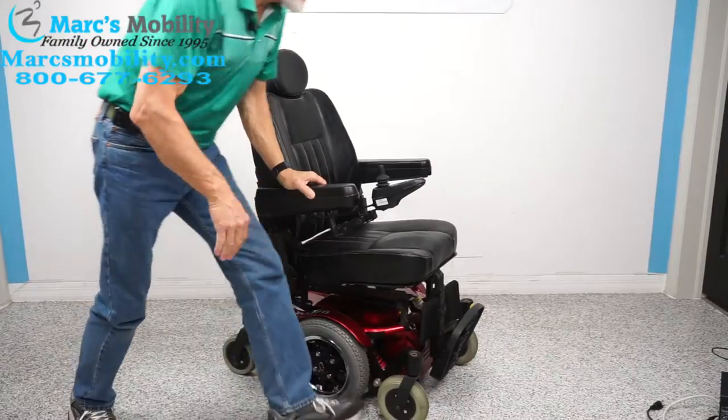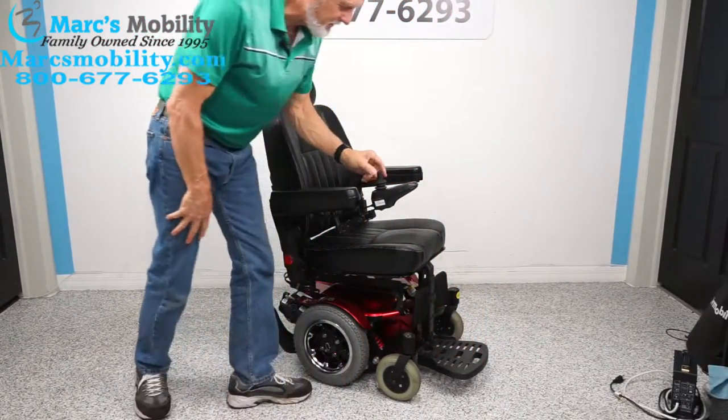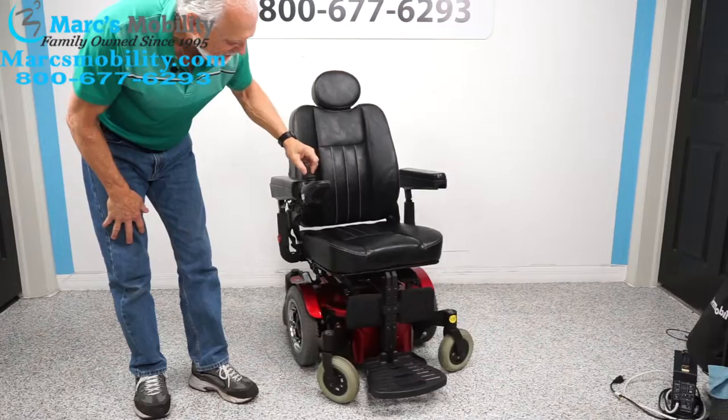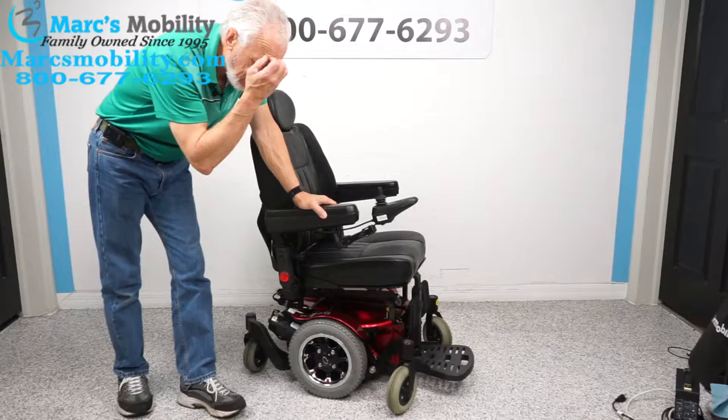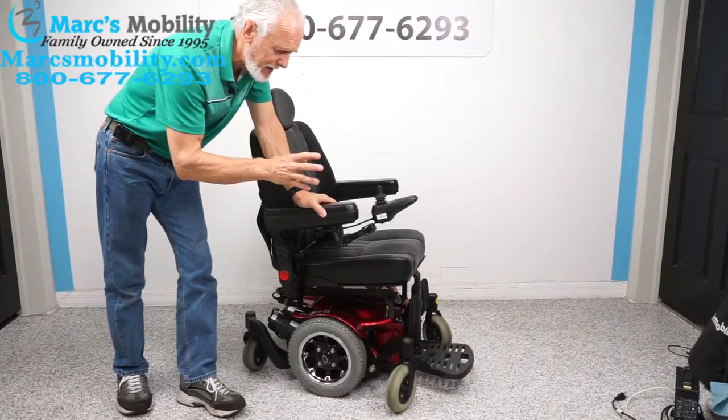That's how you change the batteries in this chair — very simple. Of course, if you don't know how it works, the first time I did it I almost took the whole chair apart. So that's how easy it is to change the batteries. This is the Quickie Pulse 6, with a 300-pound weight capacity and a top speed of six miles per hour.